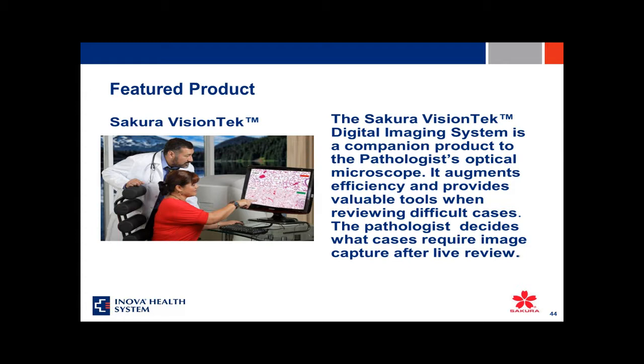What is the minimal amount of tumor cells in a section to qualify for imaging? I believe it might be a typo and it's "qualify for imaging." Again, for our studies, we said a minimum of 5 regions should be scored per slide. Those 5 regions needed at least 300 tumor cells. If fewer than 300 cells, it was questionable. If the patient didn't have enough tumor, then we accepted those. But in cases where we had good enough tumor, the requirement was 5 tumor regions, or at least 300 cells.